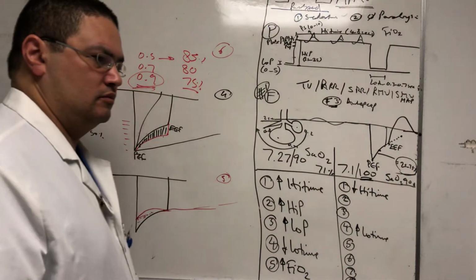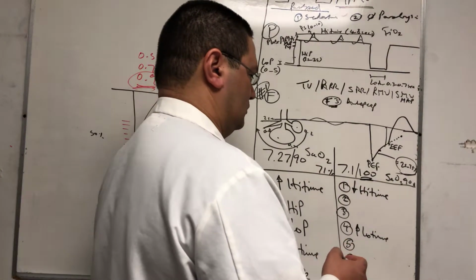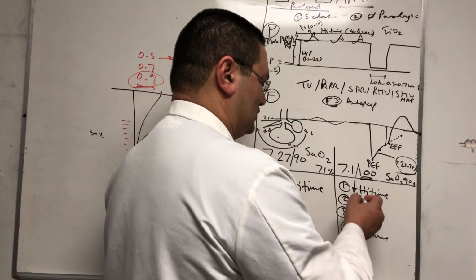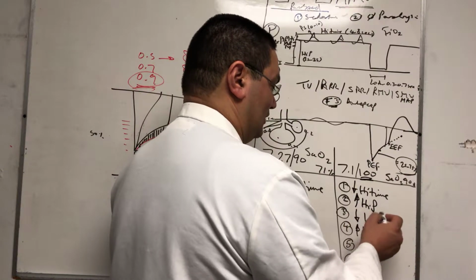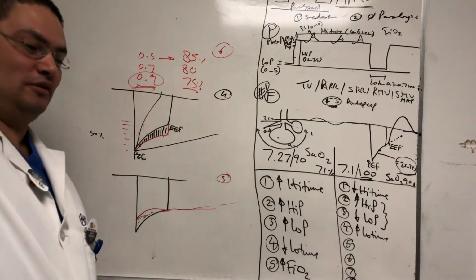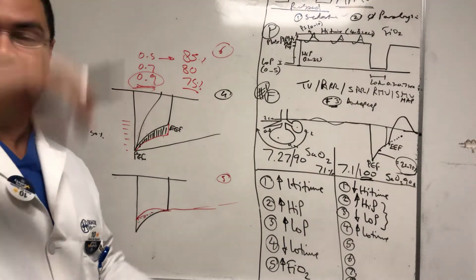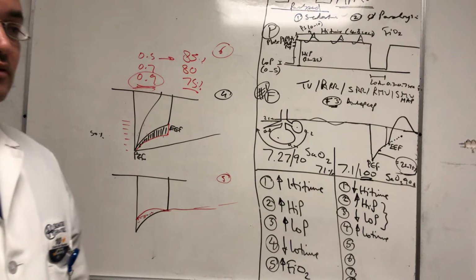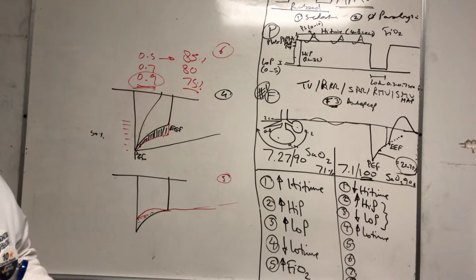What else, Megan? Decrease your high pressure? No. Okay. Try something else. How about increase the high pressure? And I'll give you a bonus. Decrease the low pressure. It's like a bypass. You're trying to increase the delta. So increase the high pressure, decrease the low pressure, and now you have a bigger Niagara Falls, right? And that will give you a bigger tidal volume. We talked yesterday about who cares about the tidal volume here. It will sometimes be huge, but the ARDS Network study doesn't apply to this one.